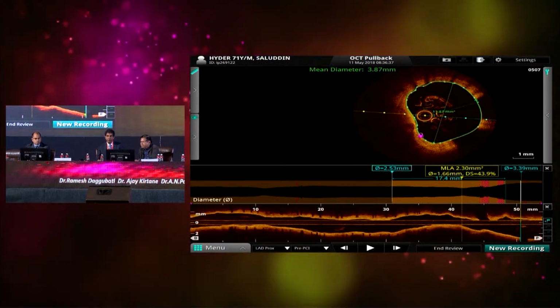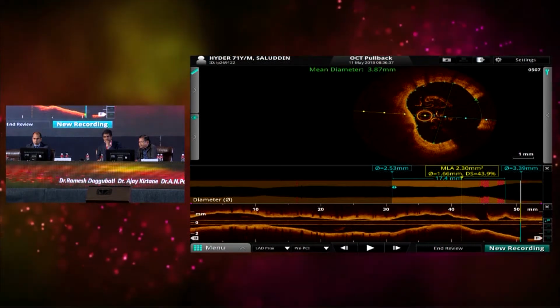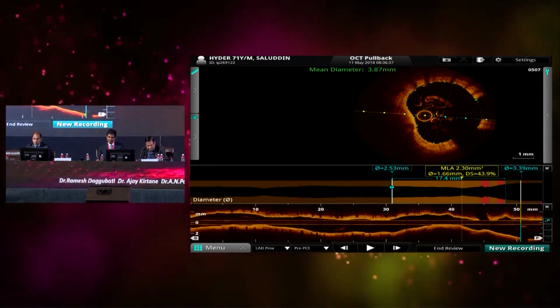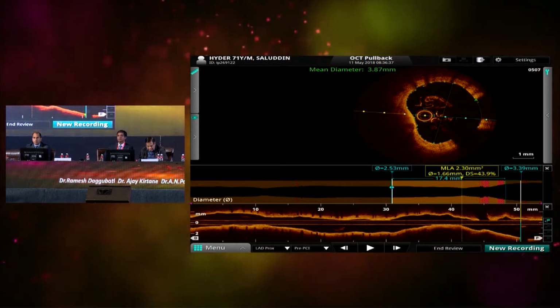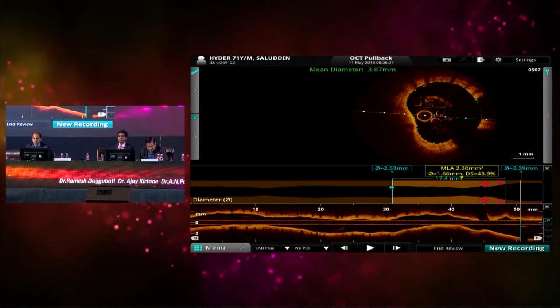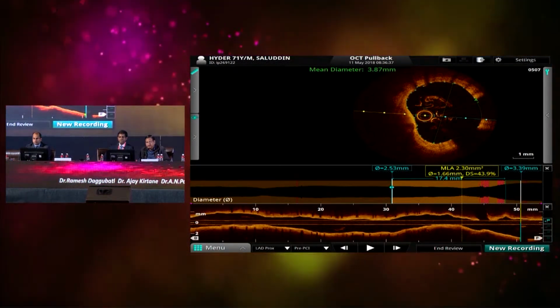I agree, but there is some discussion about how to decide the stent size, media to media or lumen. We always add a quarter size bigger than the lumen area, so it's very similar to media to media. Still, there is some discussion. If lumen to lumen is 3.87, media to media will be more. So what size do you think we should take? Ajay, what do you think?